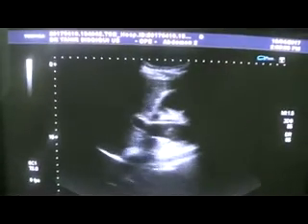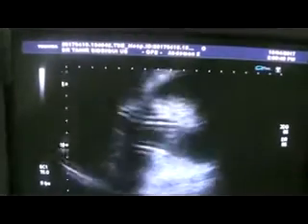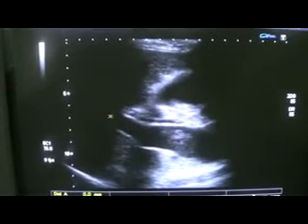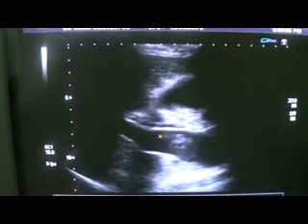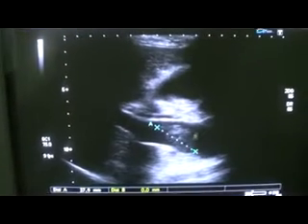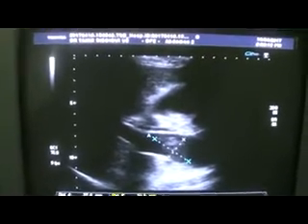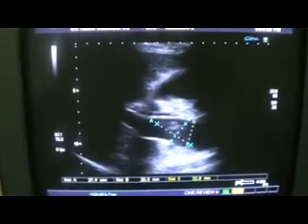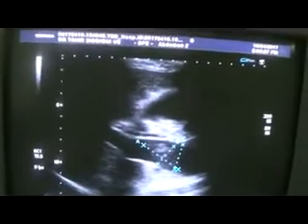This is a patient of cirrhosis of the liver. There is a clot seen within the dilated portal vein. This is the portal vein — this is the clot. It is sparing the upper part of the portal vein, and the clot measures approximately 3.7 cm x 2 cm. The portal vein measures 22 mm; up to 13 mm is considered normal. This is what we are seeing in black and white.